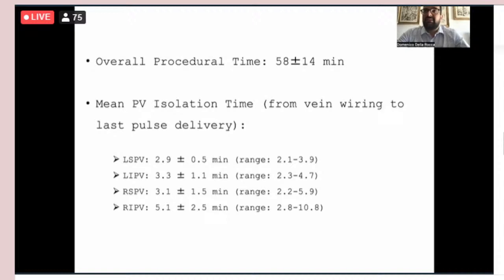In this case, in addition to trying the maneuver of coming back and dragging back from the right inferior, another maneuver that can allow falling into the right inferior is deploying the catheter in a flower configuration on the posterior wall, dragging back and clocking the system towards the right, towards the septum. Sometimes it's easier, especially if the atrium is very small, to target the right inferior.